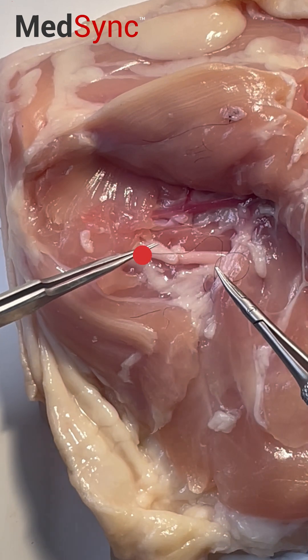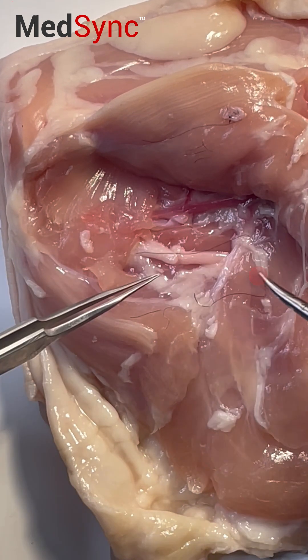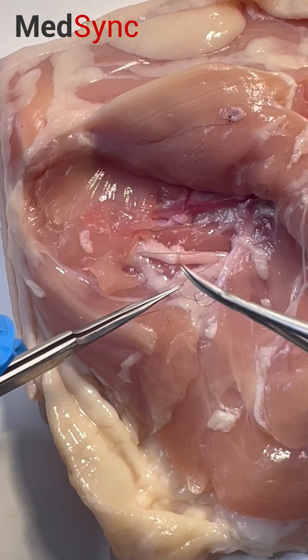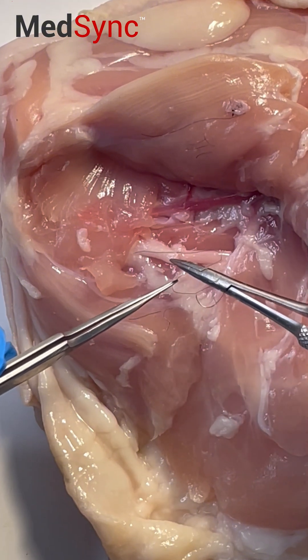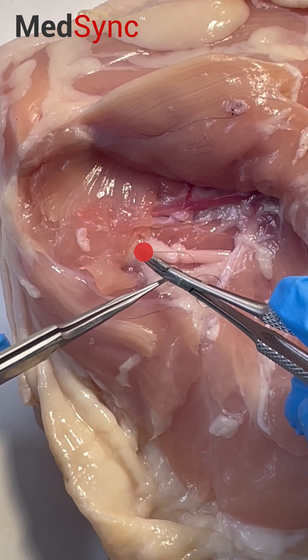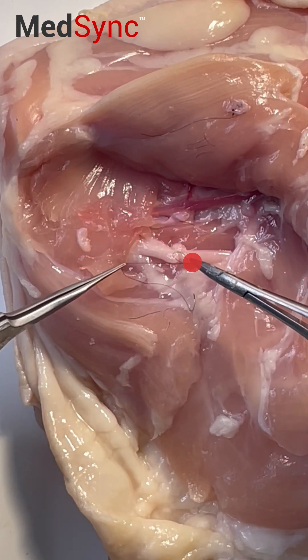And now that suture needs to end over here. So I'm going to pass the long suture to the forcep. For economy, I'm going to turn the needle holder with the tips down, wrap around the tip of the needle holder, and grab the short suture and bring it to its final position.